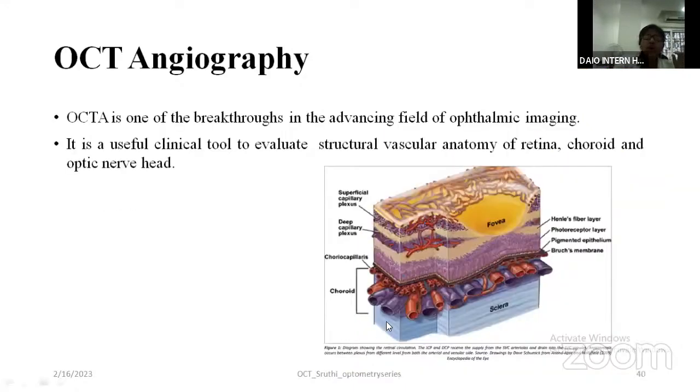Now, next move on to OCT Angiography. OCTA is one of the breakthroughs in the advancing field of ophthalmic imaging. It is a very useful clinical tool to evaluate structural vascular anatomy of retina, choroid, and the optic nerve head.